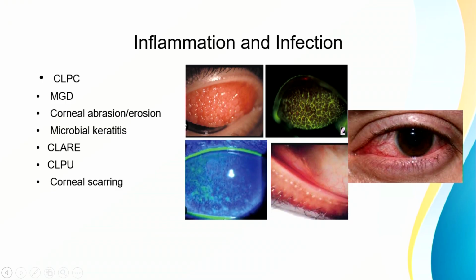So that one. Then microbial keratitis, I said earlier, the lens case changing, lens case storage is really important, where again the microbes can just come up, and we have an infection.